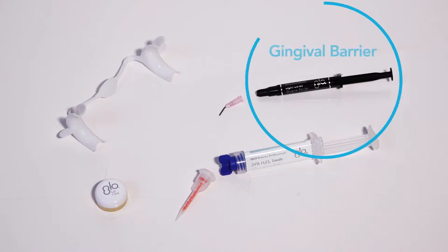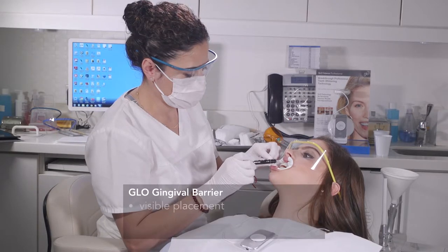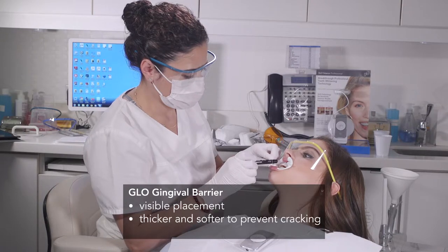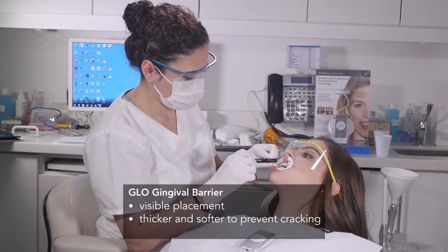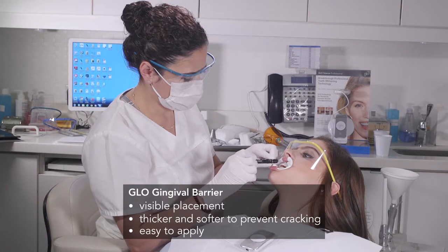Now you are ready to apply the Glow Gingival Barrier. The Glow Gingival Barrier has some unique attributes. It is a light blue color so that you can see where you place it. It is also thicker and softer than other gingival barriers, designed to prevent it from cracking so the gel won't migrate onto the soft tissue. It's also really easy for you to apply.